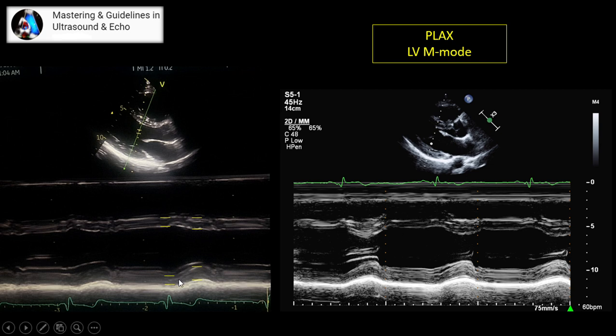And for the posterior wall, just remember we don't include chorda tendineae or papillary muscle. As you notice in this 2D image, anterior to the posterior wall we have a hyperecho line that is a chorda tendinea, which on M mode we can see as a hyperecho line separate from the posterior wall. You see here hypoecho between these two parts. So we know this is chorda tendinea. We don't include that one, and we just measure the real myocardium thickness.